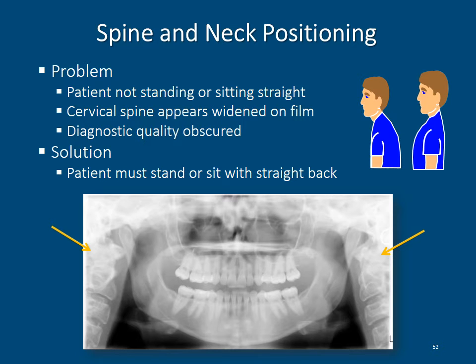The curvature of the spine is more advanced, aggravated, or exaggerated with adults. So this slight lean inward to the machine, causing them to support themselves just a bit, helps to erect the head and neck properly to avoid the cervical spine appearing in radiographs.